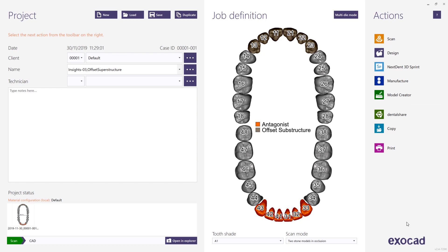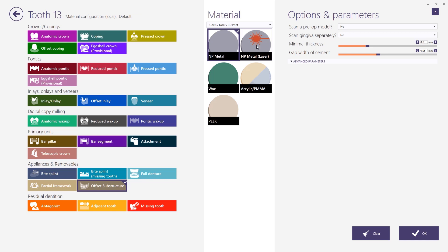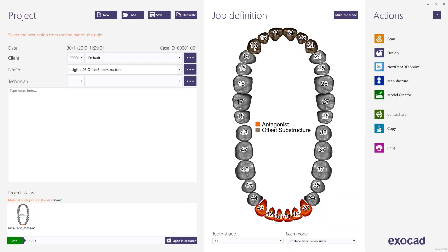To start, we need to define the offset substructure in DentalDB. We do this by clicking on element 13, select offset substructure, select the right material and press OK. We did this for element 13 until 23. To visualize the distance between both jaws we also implemented a lower jaw as antagonist. Click save and design to go through the design steps.